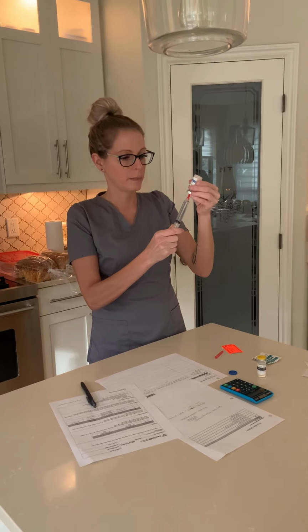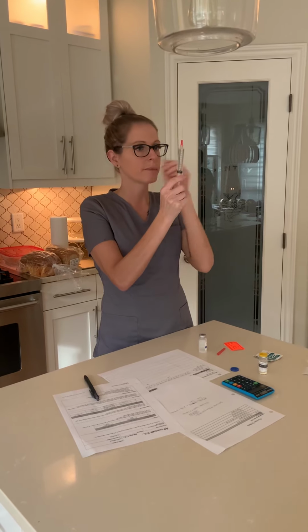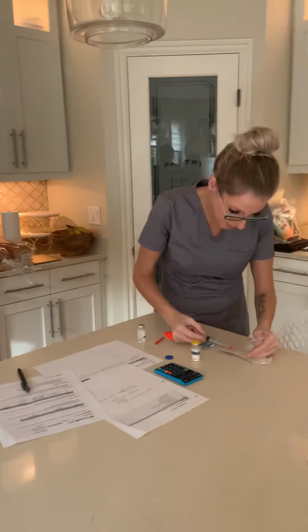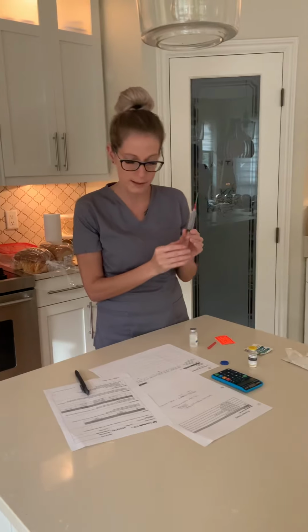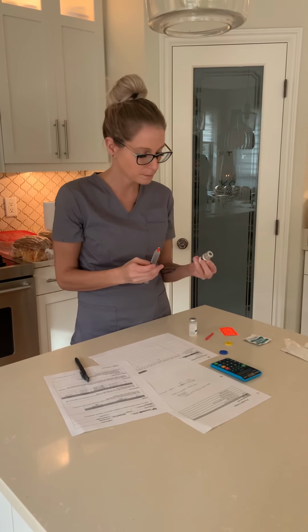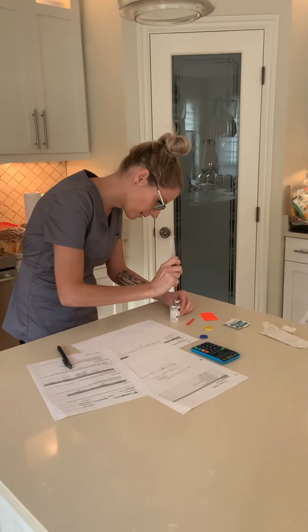I'm going to draw a bit of air back just so it doesn't spray at me. A bit of extra water, I'll just get rid of that. Okay, so I feel good. There's no air bubbles. I've got my 9.6 ml sterile water. Next thing I'm going to do is double check this medication, and I am going to insert that in.